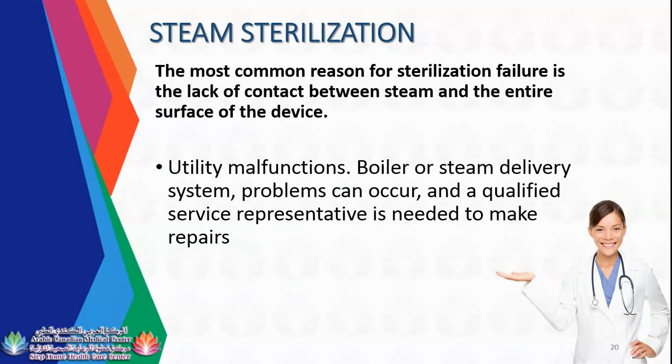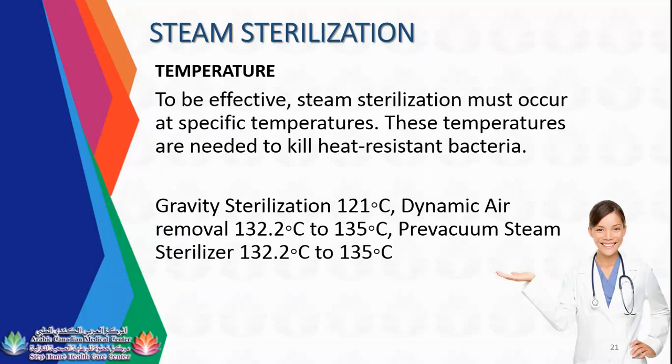Utility malfunction: boiler or steam delivery system problems can occur, and a qualified service representative is needed to make repairs. To be effective, steam sterilization must occur at a specific temperature. These temperatures are needed to kill heat-resistant bacteria. So it's 121 to 135 degrees Celsius.